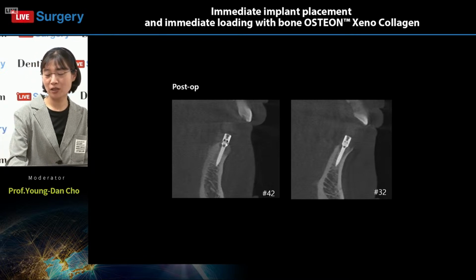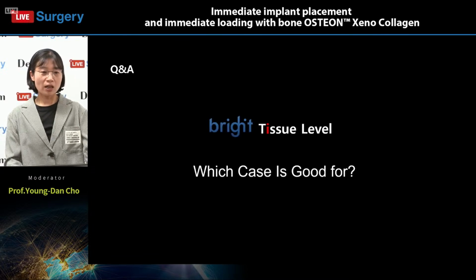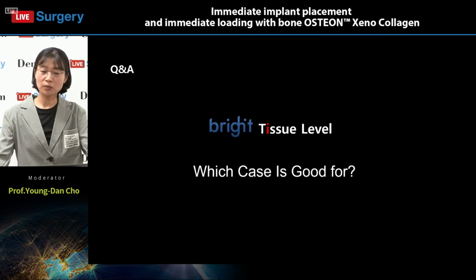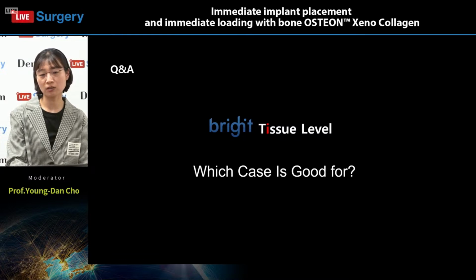So I think today's surgery is very perfect because Dr. Jung Park is a professional surgeon. So we got a question about the bright tissue level implant. The question is which case is good for the bright tissue level implant.